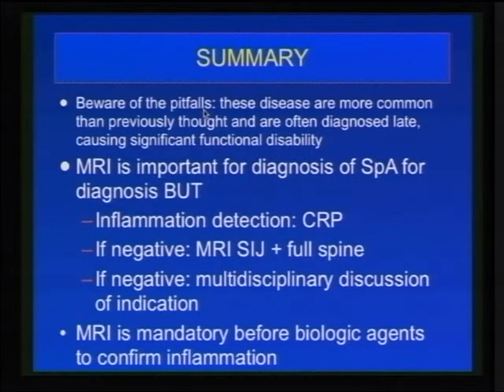of spondyloarthritis. MRI, I said, is very important to discuss the cases of acute or chronic, or the mixture, which is acute on top of chronic changes. So these are the important issues. We should not omit the importance of clinical data, CRP, HLA-B27 positivity. So we should have a close relation with the clinicians. And MRI is an important issue to do nowadays before giving the patient biological agents. So it's very important to do a baseline examination and then do the follow-up.